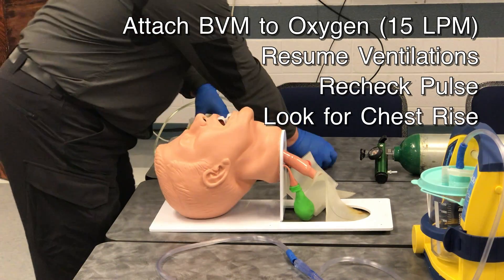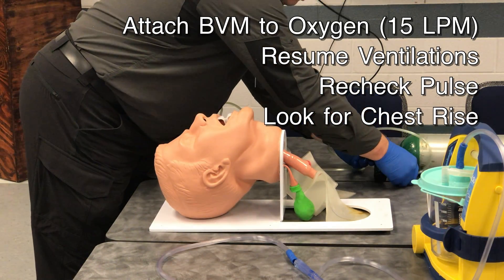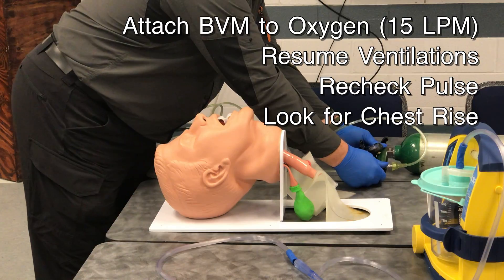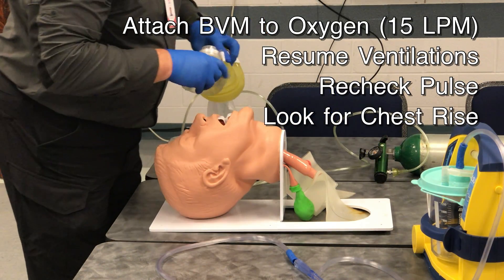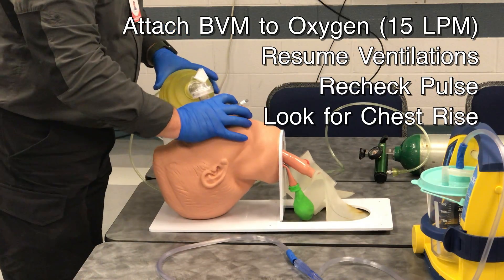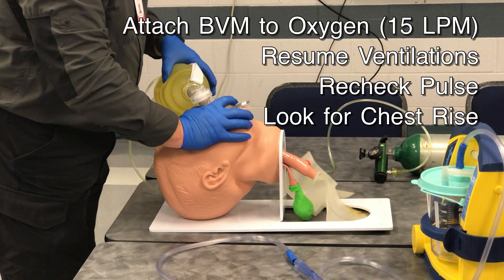I will then attach it very quickly to oxygen, setting it at 15 liters per minute. Continue to ventilate the patient — one breath every five to six seconds at 15 liters per minute.